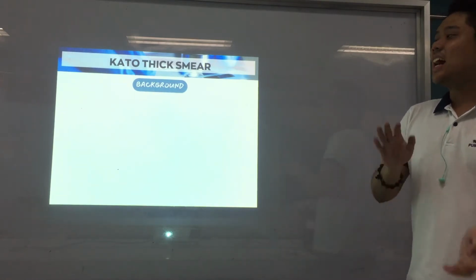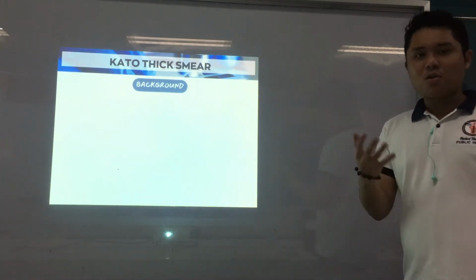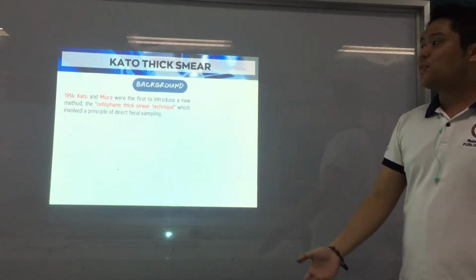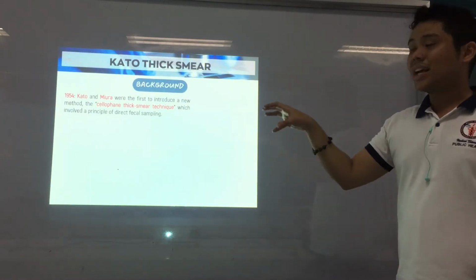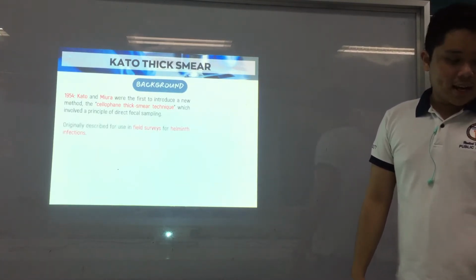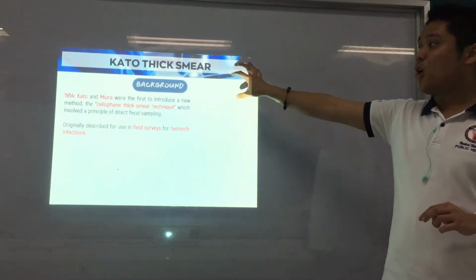So we'll start first with the Kato thick. It's named after the discoverer. We have Kato and Miura in 1954. They were the first to introduce a new method known as the cellophane thick smear. So that's the other name of Kato thick, guys: cellophane thick smear.